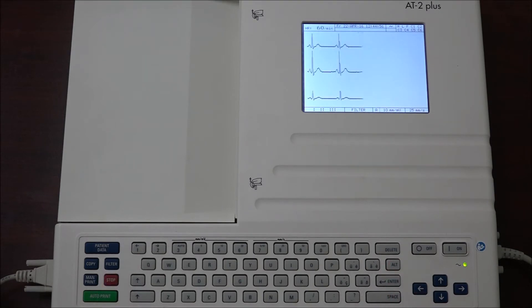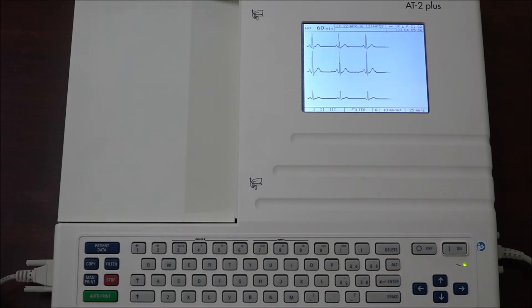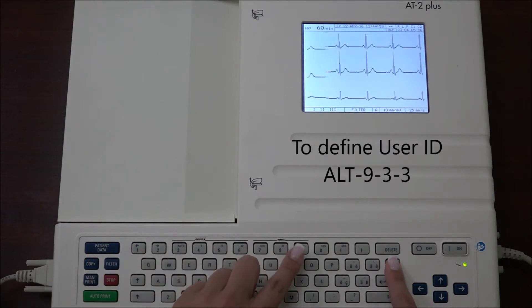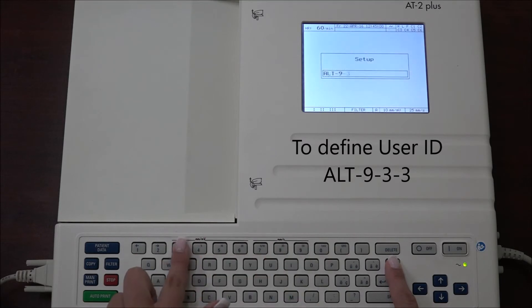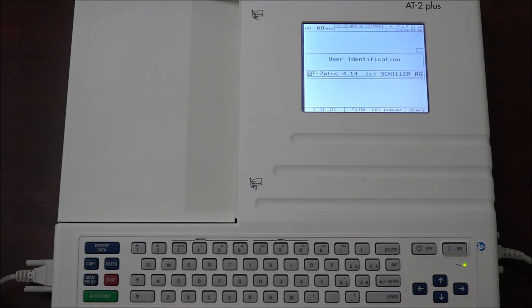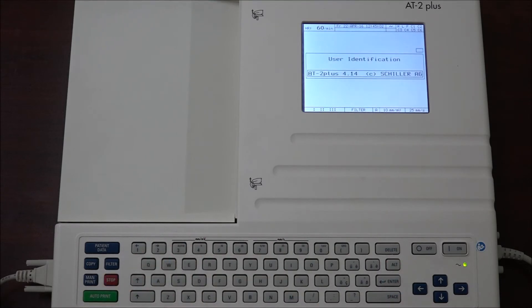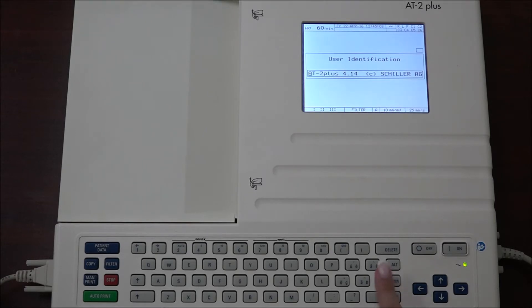In order to define the user identification, press ALT 9 3 3 and enter the user ID that will be printed on all recordings. The user ID can be the department, doctor, or hospital. Confirm the new user ID by pressing the enter key.